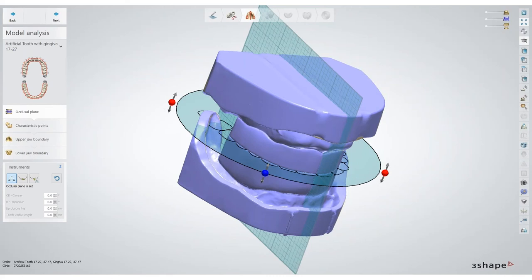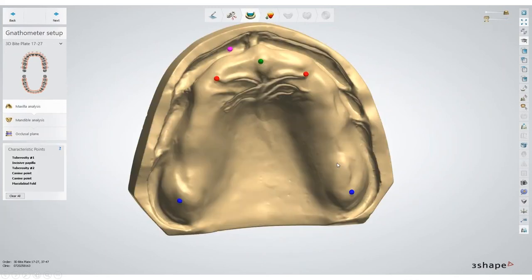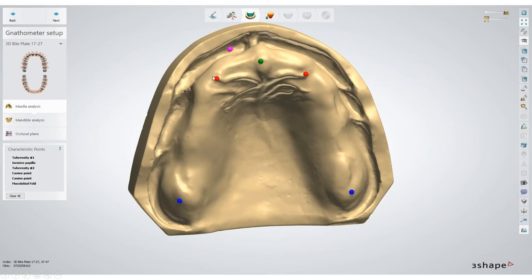Let me go through a couple of steps in 3Shape on how we set up these cases. When we bring things in, this is just a regular demo case — regular Vita models — so we have upper, lower, and a bite registration. It's very important to understand model analysis, because the way the software sets up dentures is based on model analysis. It looks at the incisive papilla and determines that the incisal edge will be seven to nine millimeters from the center of the incisive papilla. The two major pairs of palatal rugae are your canine lines — that's what it uses for the initial setup.